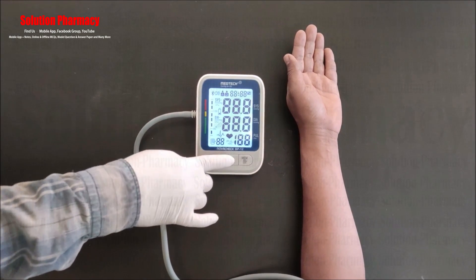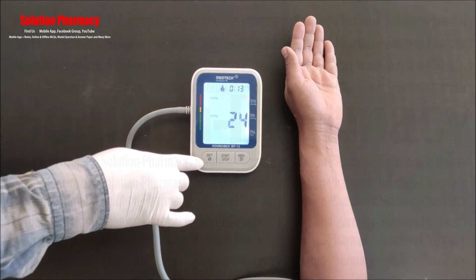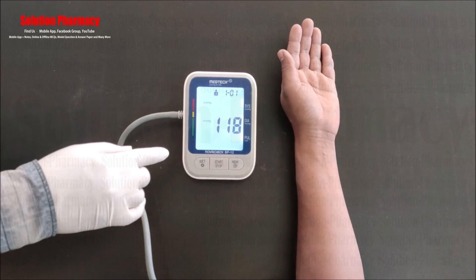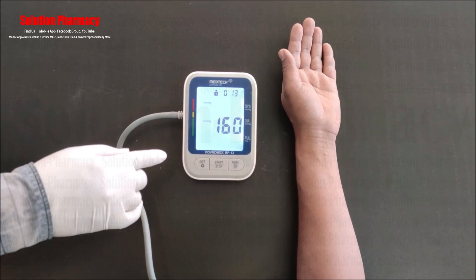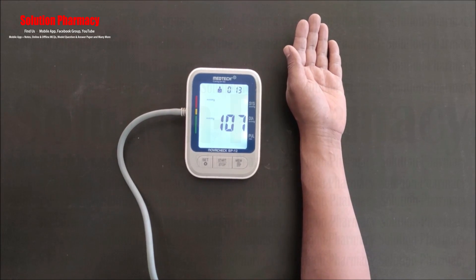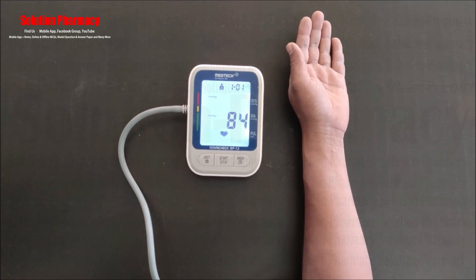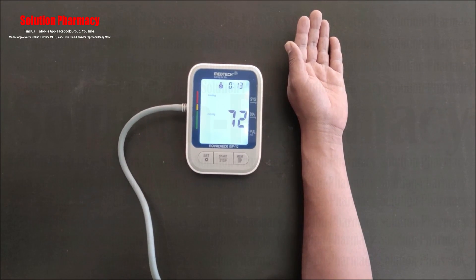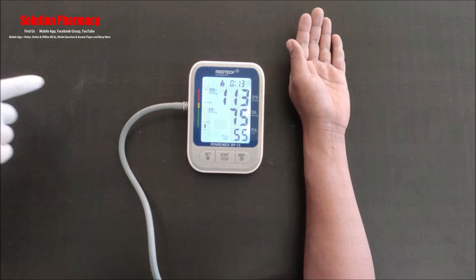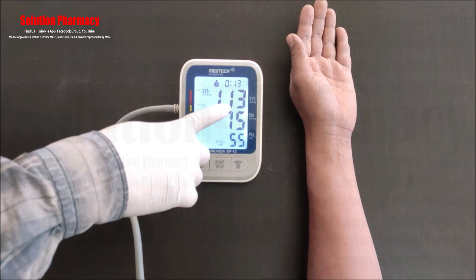Press the start button. The pump begins to inflate the cuff and the rising pressure is shown on the display. Pressure increases to the working level, then the pump stops and pressure falls. The heart symbol flashes with every heartbeat once the pulse is detected. Note: wait at least 30 minutes after exercise or bathing, and avoid coffee, tea, alcohol, and tobacco for at least 30 minutes before measurement.